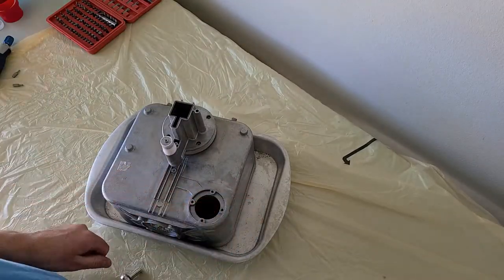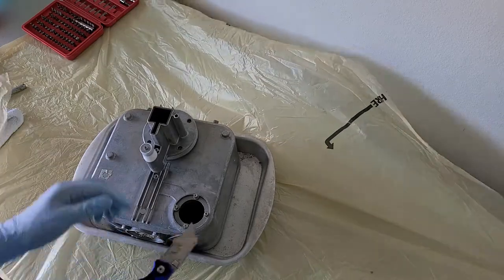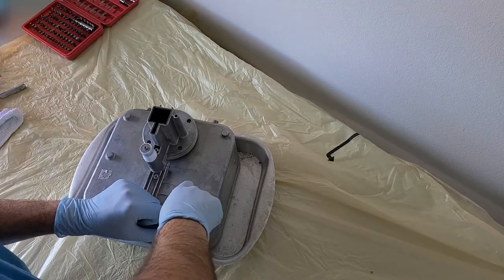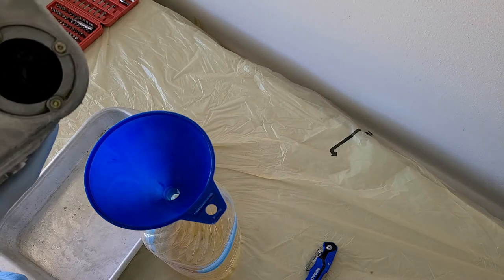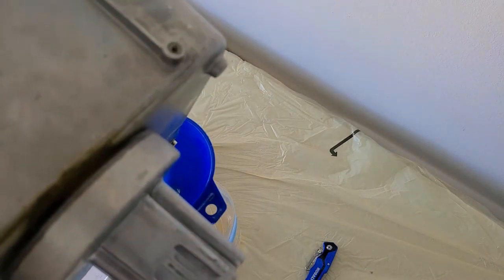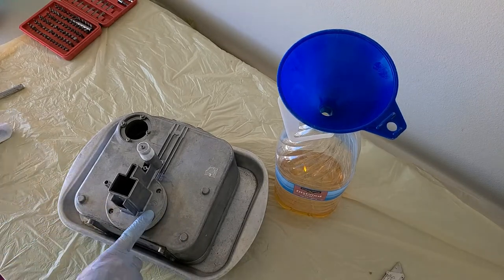Alright, so that's not going to work. There's something stopping the ring from going down. So I'm going to have to figure something else out. Alright, because this oil is so messy, I'm just going to go ahead and poke, cut a hole into the rubber and drain it out through here. It's just kind of draining really slowly. Maybe I can make a bigger hole. So that's not working too well. I'm going to go ahead and take these screws out now and take off that cover.